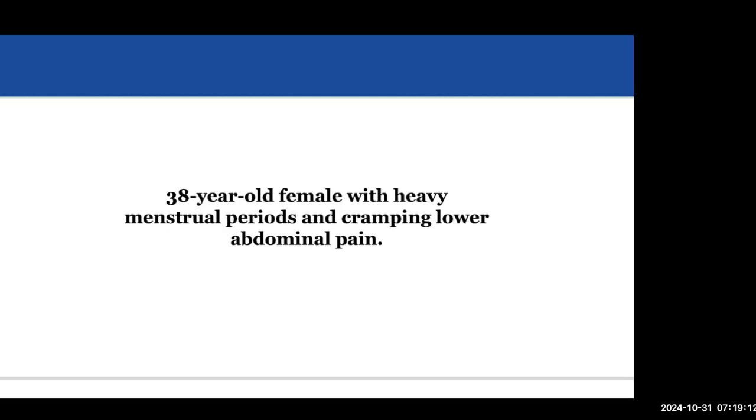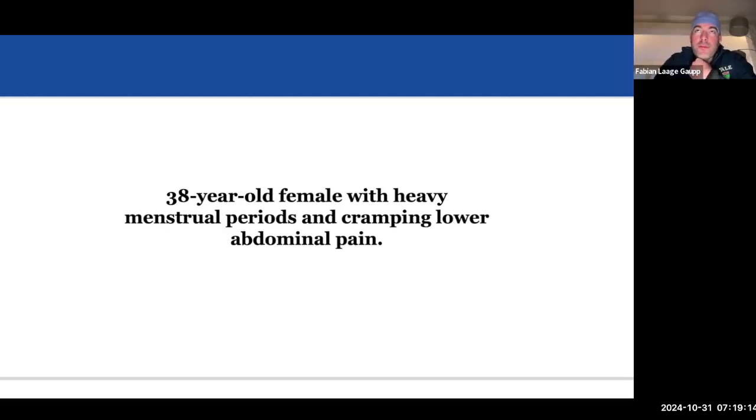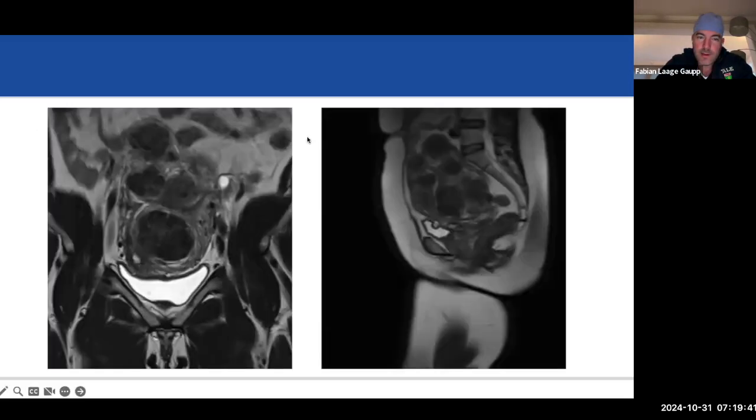And the other reason to get the MRI is also to rule out malignancy, right? Yes. Because with ultrasound, you can often see there are fibroids, but if you have a woman with bleeding, especially if someone is older, you should be suspicious. And MRI can be very helpful to rule out that there's malignancy on top of what you already said.